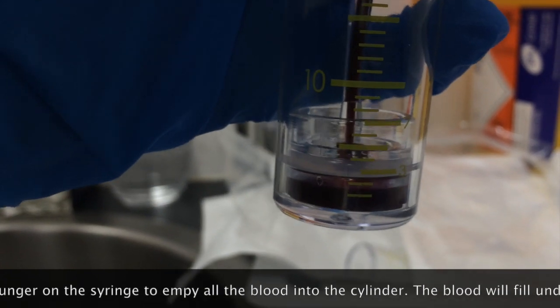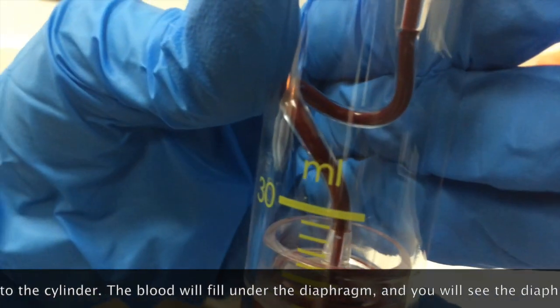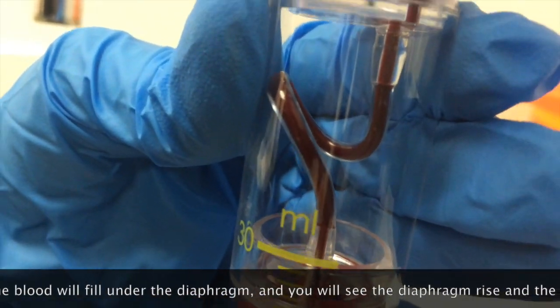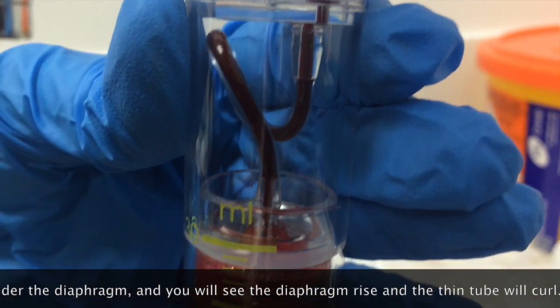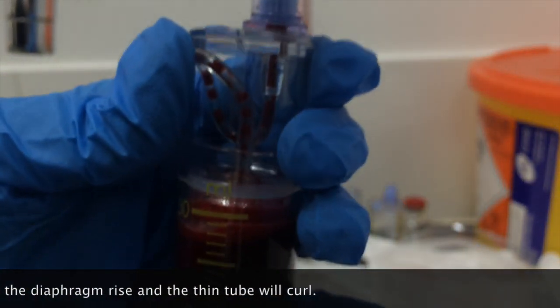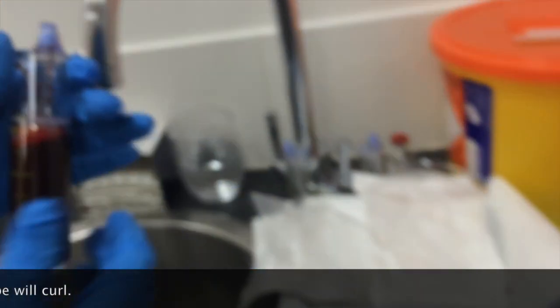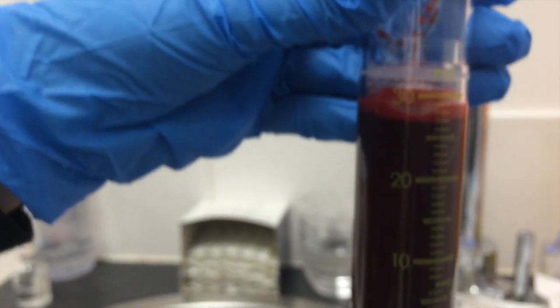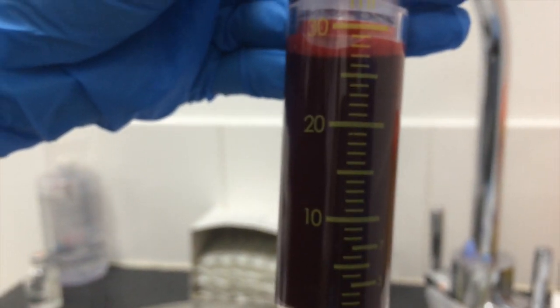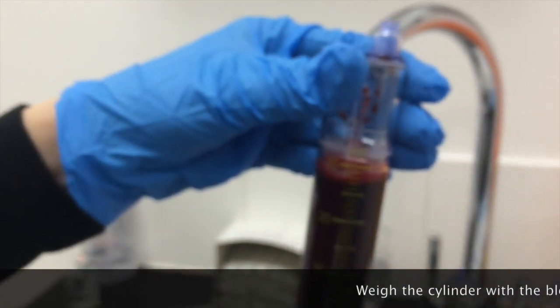The blood's going to come out and you can see that little tube start to curl. Now you can hold that up and see the diaphragm — you can see the whole blood under the diaphragm. So this is all the blood down there.